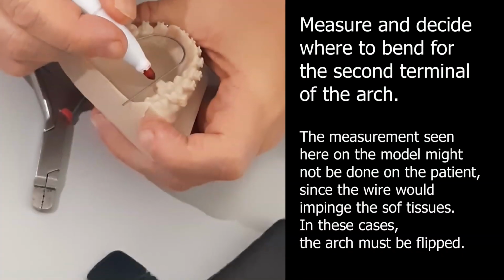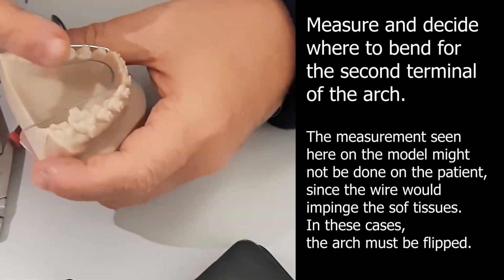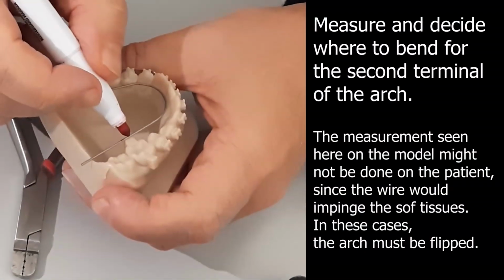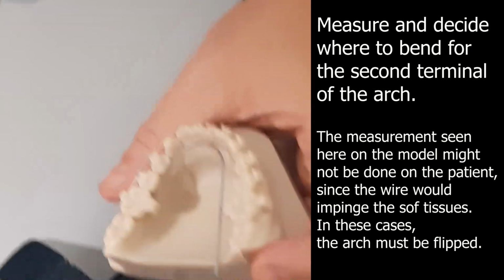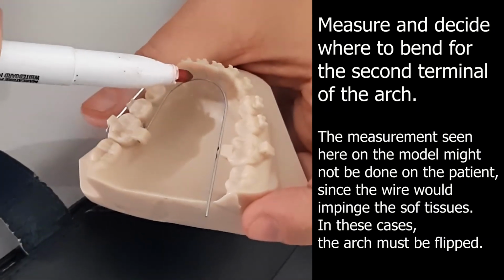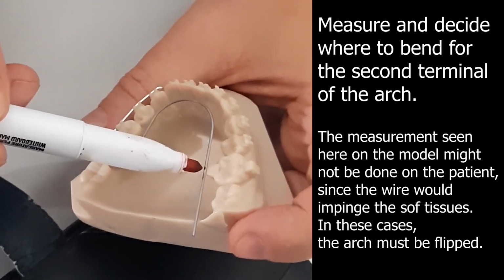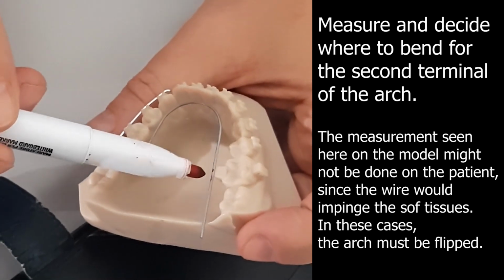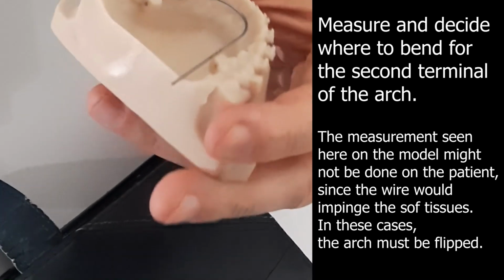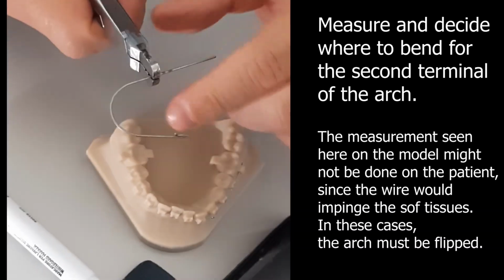So I'm interested in a lower molar. Let's imagine you want to mesialize this lower molar. So first of all, I would do it a bit shorter. If I bend it here, it will be more or less this length. If I bend it here, it will be shorter. And if I bend it here, it will be even shorter. So it's not very complex. Yeah, that's nice. So we'll make this quite short.